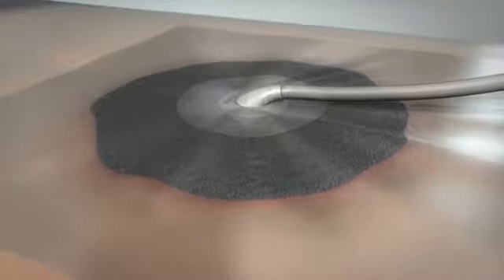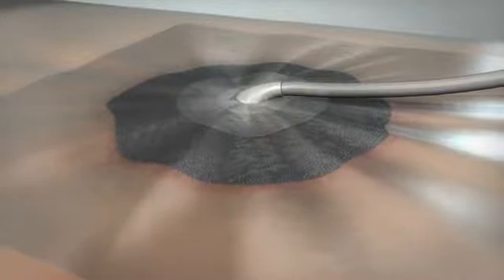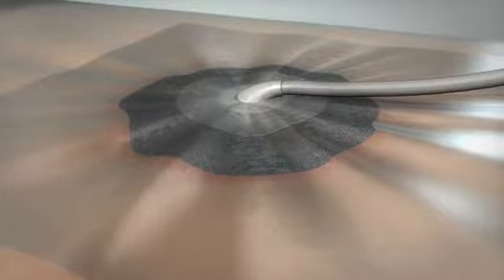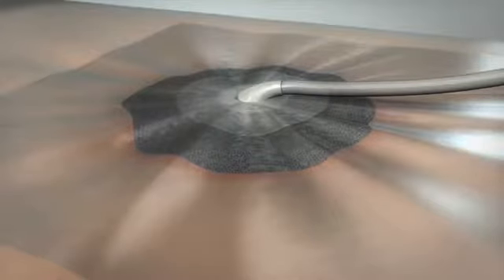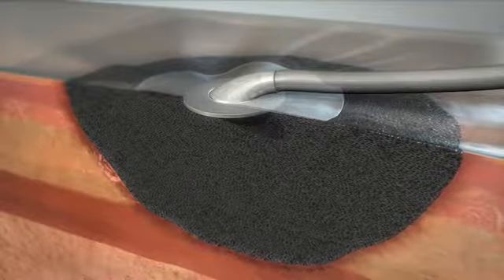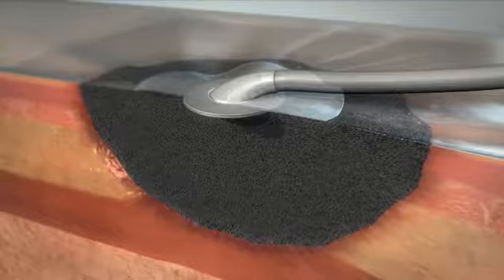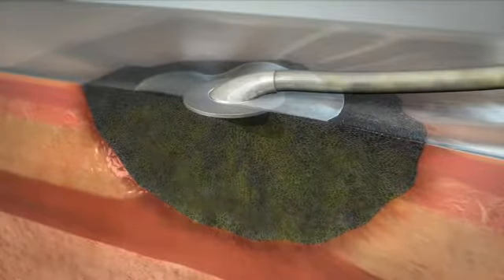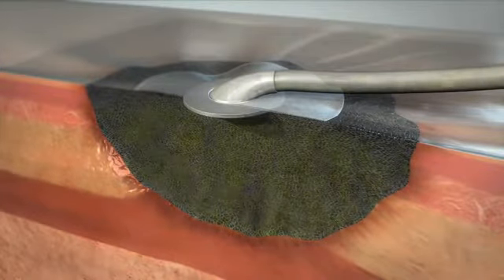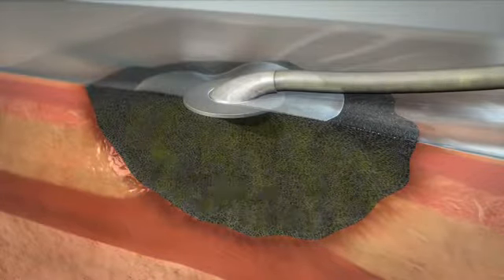In combination with sophisticated software, TRAC technology helps provide uniform negative pressure to the wound surface. It also provides alarms when there are conditions that would impact negative pressure wound therapy. The application of uniform negative pressure when delivered by VAC therapy induces a physical response, macrostrain, and a biological response, microstrain, that removes exudate and infectious material, reduces edema, and promotes perfusion and formation of granulation tissue.